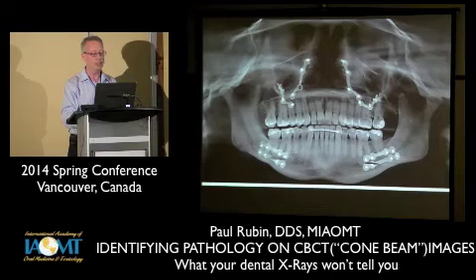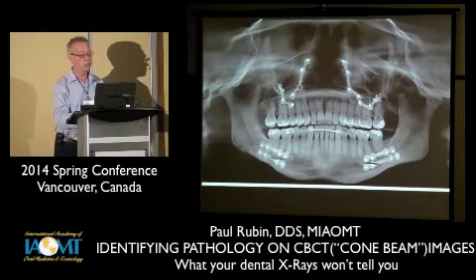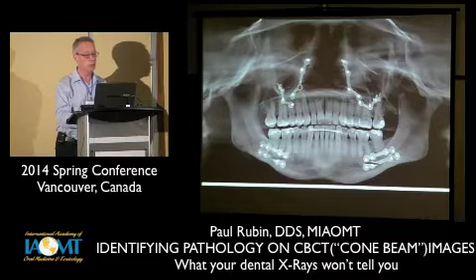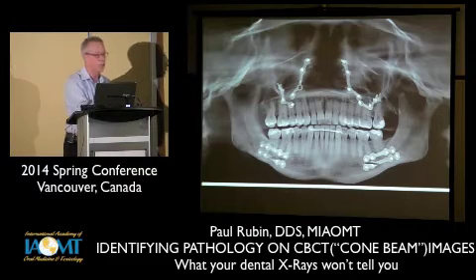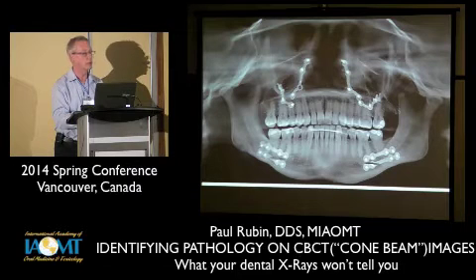So here's an interesting patient that had orthognathic surgery when she was a lot younger. She's still a fairly young woman here, and she's having pain symptoms on number 31, which when we look closely at it, it's a little hard to see through the metal plates here, but there is some periapical pathology. She absolutely did not want a root canal. She wanted that tooth taken out.